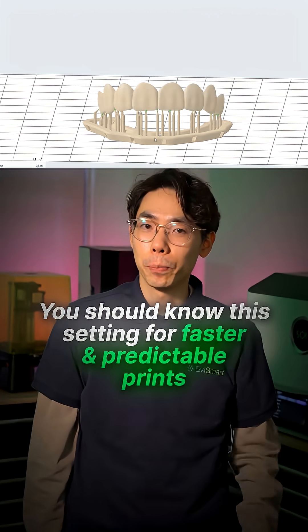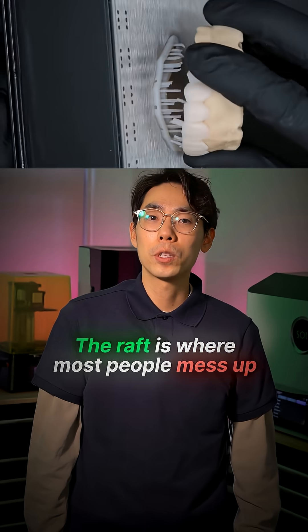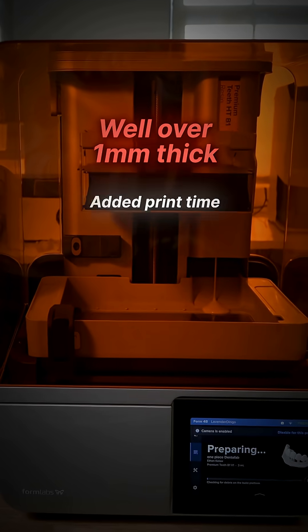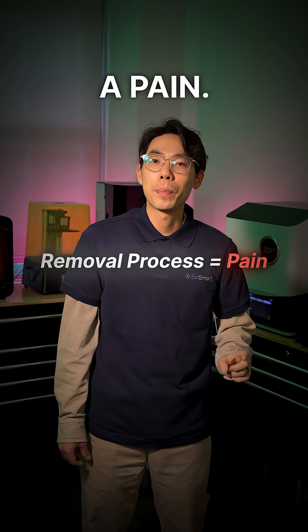If you want faster and more predictable prints, you need to dial in your support settings. And the raft is where most people mess up. Most default raft settings are well over a millimeter thick, adding to your print time, wasting more resin than necessary, and making the removal process a pain.